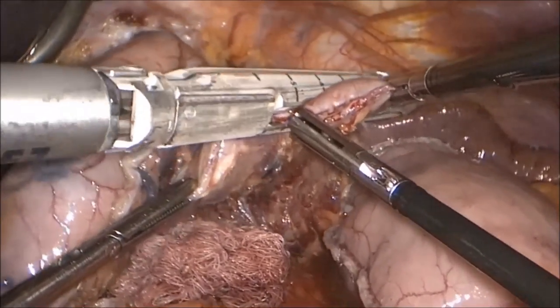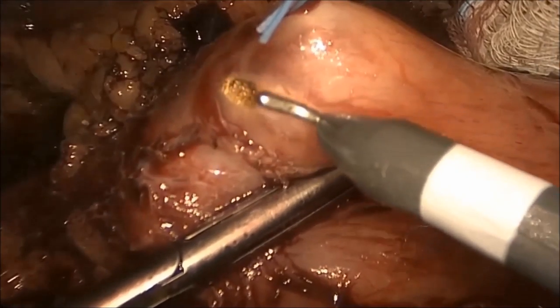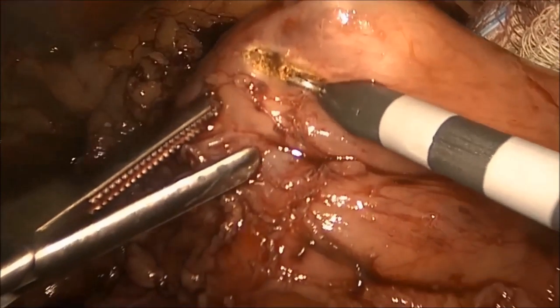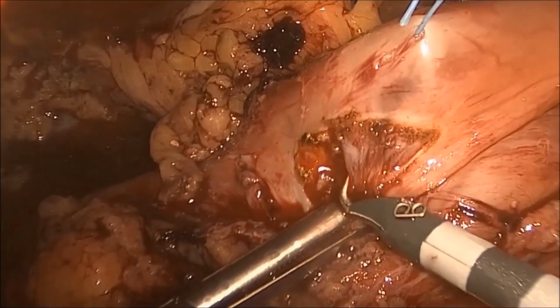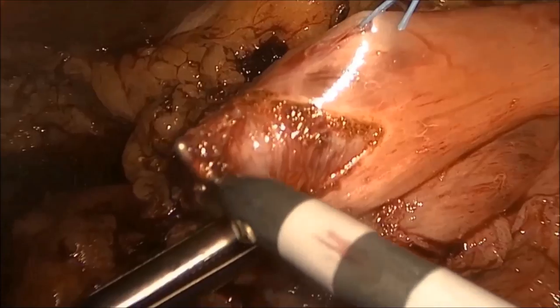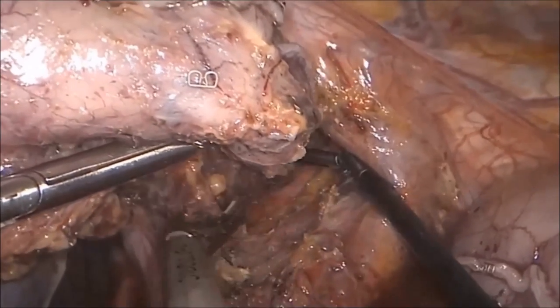Distal margins are taken from the lateral border of the specimen and sent for frozen section. A pyloromyotomy is then performed with an L-hook, which helps to improve gastric emptying. In order to minimize the loss of pneumoperitoneum, the phrenoesophageal ligament is left intact until the conduit is completed.